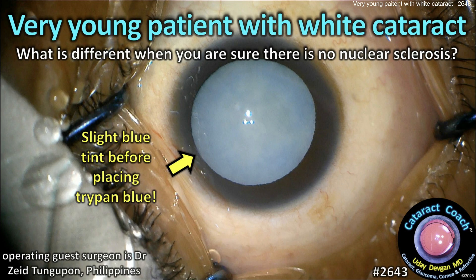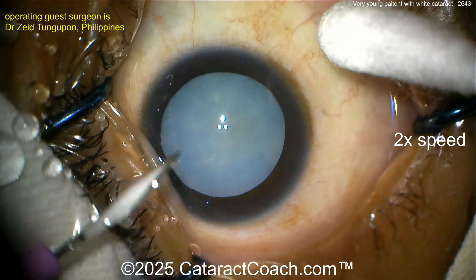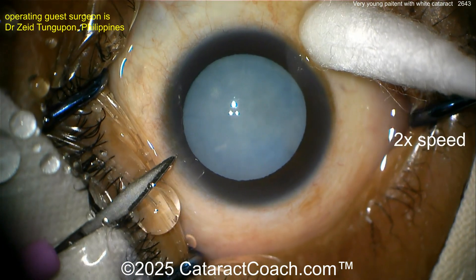CataractCoach.com. A very young patient with a white cataract. Now what's different when you're sure there's no nucleosclerosis? Look at the case very carefully. Look at that picture here. This is before trypan blue dye and it still looks bluish. The cataract is so white that it looks bluish.